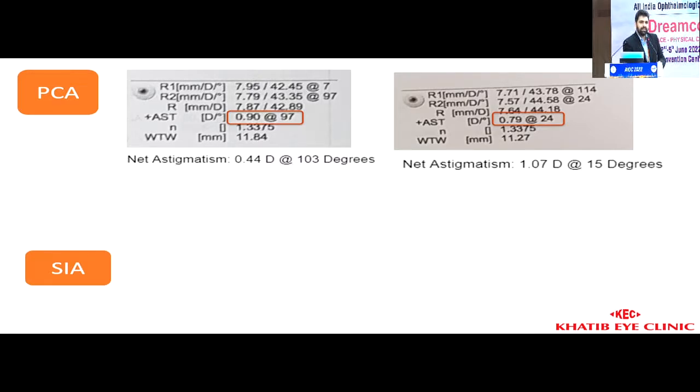Fortunately for us, most of the modern-day calculators, even if you can't measure, have very good nomograms, and this is taken from a nomogram. So there is nothing much that you have to do yourself. You can easily just feed in the posterior corneal nomogram and this will be taken care of. But understanding it is important.